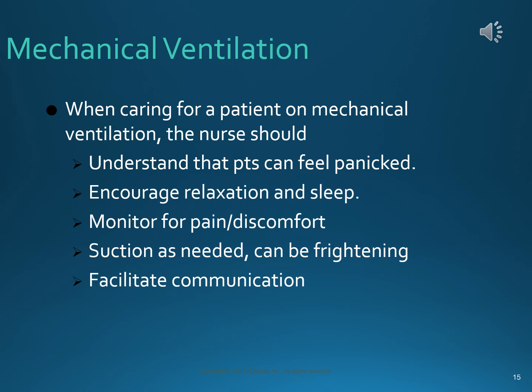Suction as needed, but remember, suctioning can be frightening. You are literally sucking the air out of them. So be sensitive to that and really try to help them remain calm, stay and talk them through it, and stay afterwards if you need to. Explain every single thing you're doing. And then also facilitate communication, because if they're on the ventilator, they're not going to be able to talk. So you need to find a communication board, piece of paper and pencil to write, whatever it is that they can use to communicate with you.